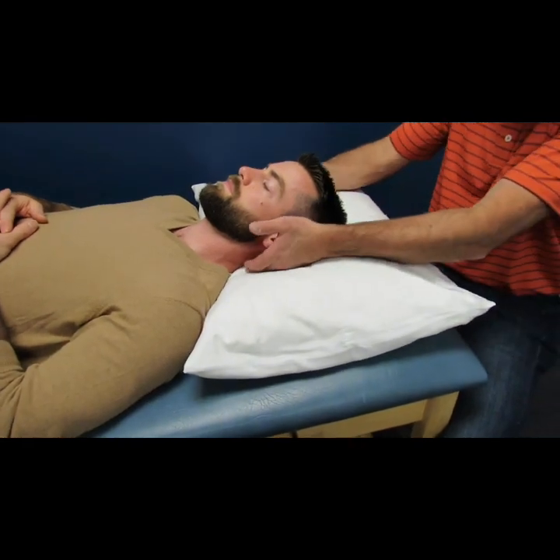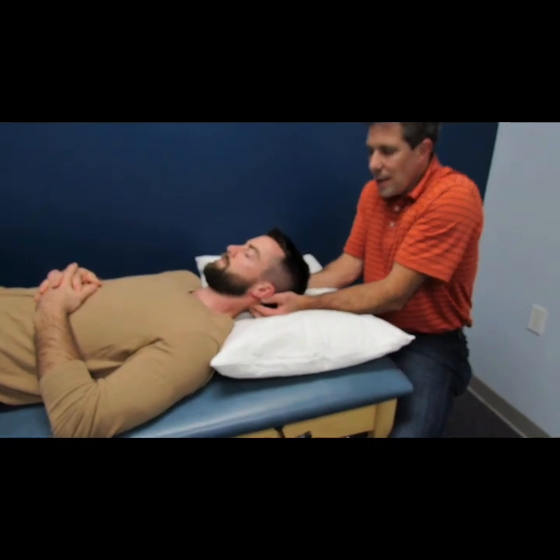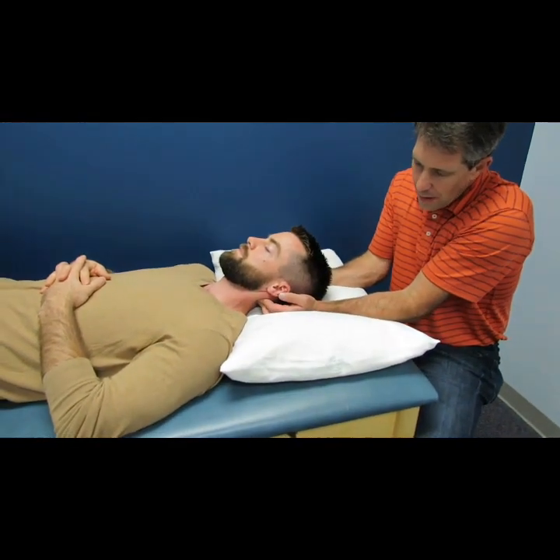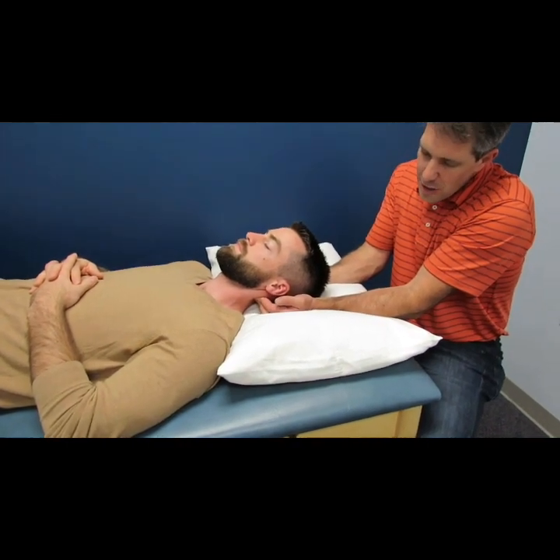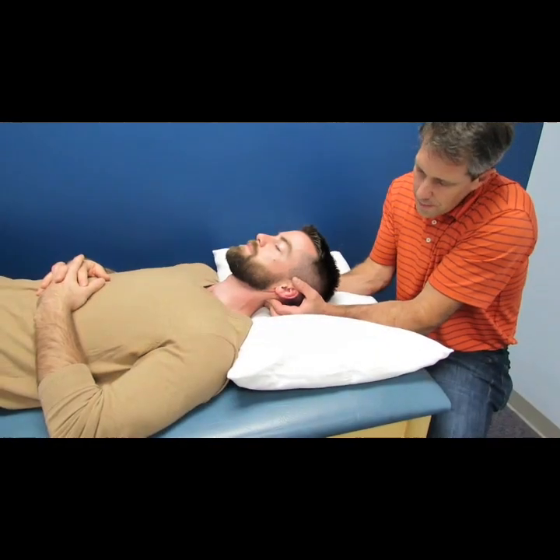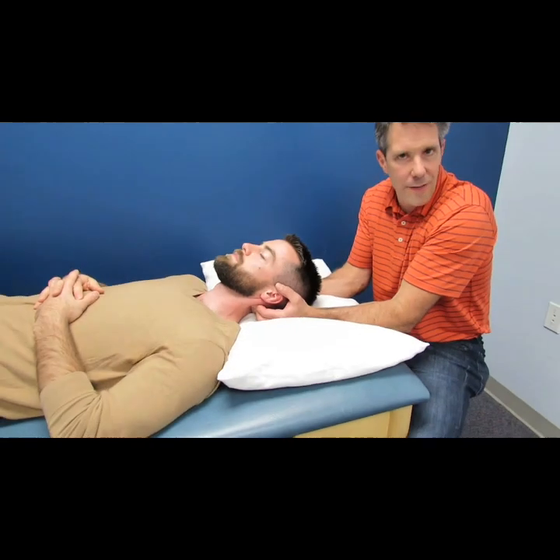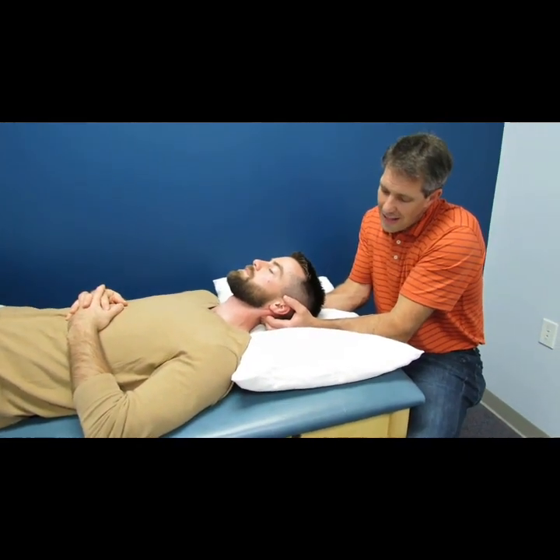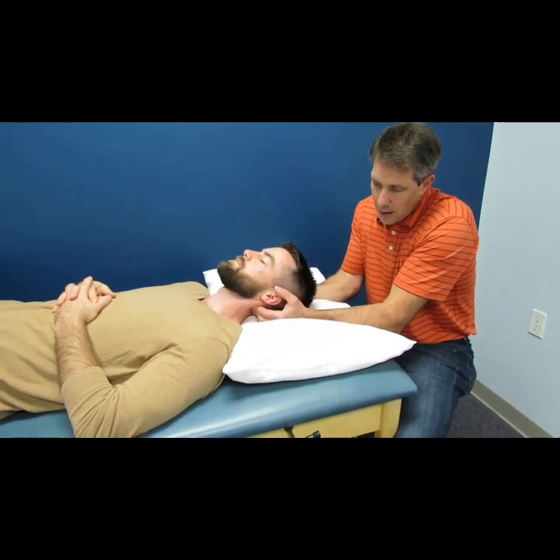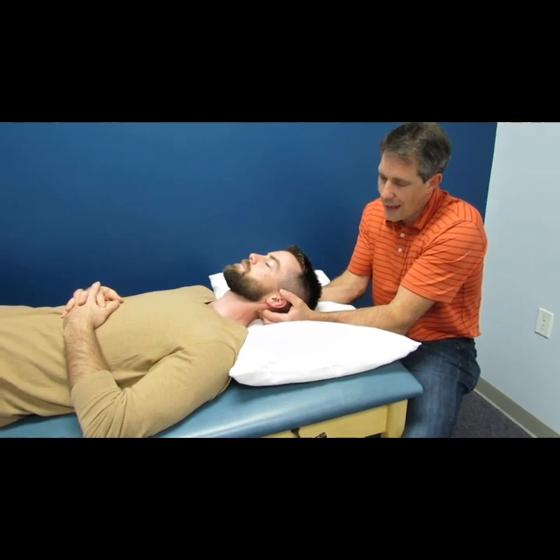Okay, those muscles have a lot of Golgi tendon organs which, when stimulated, give you a little inhibitory effect, so they help to relax the muscles around the posterior cervical spine. So I may just put a little bit of pressure there and try to keep him pretty neutral, and I might just spend some time there with some pressure. Okay, not necessarily giving him traction, but just kind of letting those muscles become inhibited a little bit, get him to relax some. Sometimes dimming the lights can help, and just really trying to get him to relax.